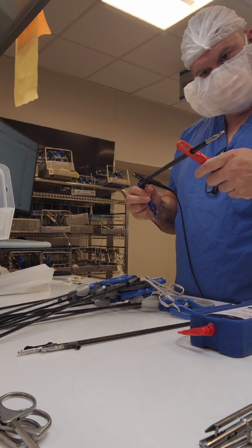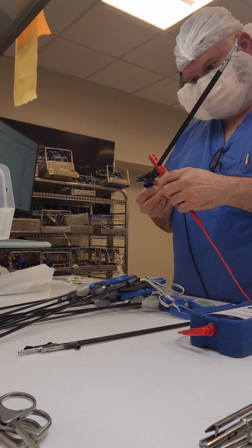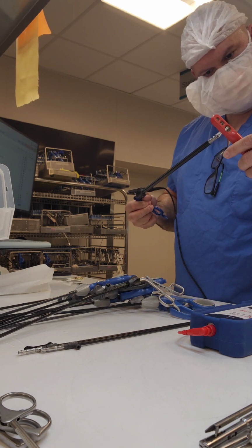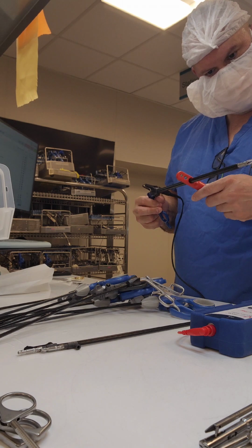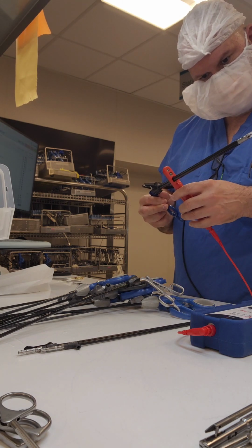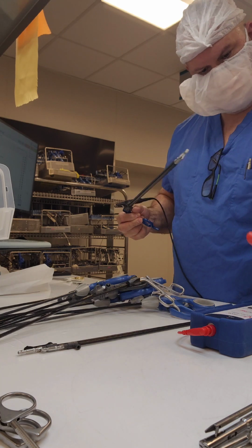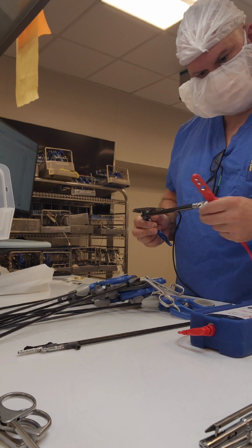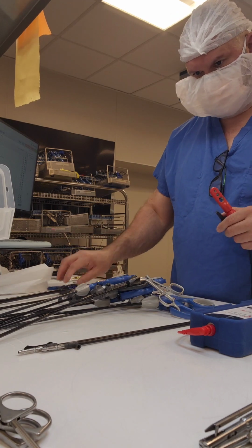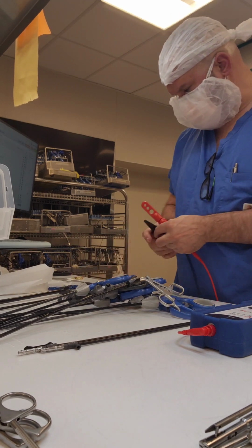Oftentimes when you have missing instruments from a set, you need to confirm with the OR, hey, this instrument set is missing this instrument. Can the surgeon still utilize it? They may in fact tell you, no, he needs 2 of those in that set, and if you do send that up, we're going to pop open another set. So not quality, guys. Usable, yes, not quality.